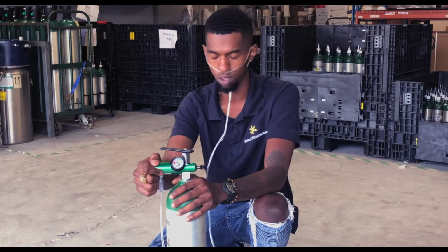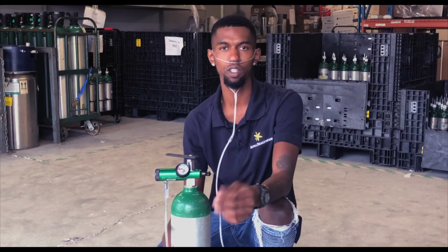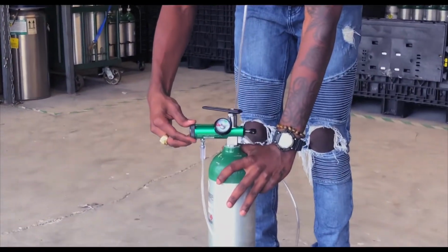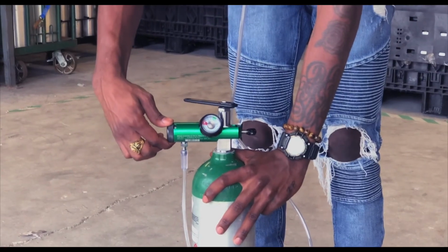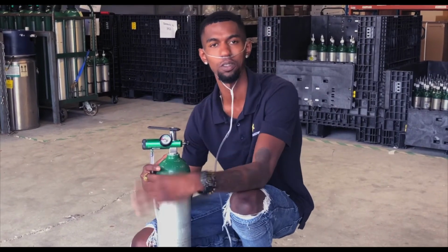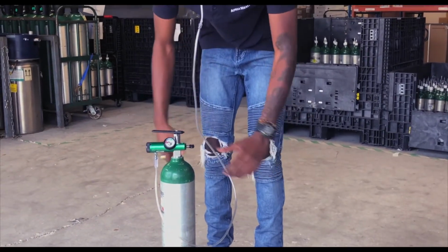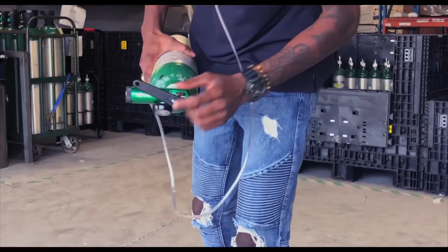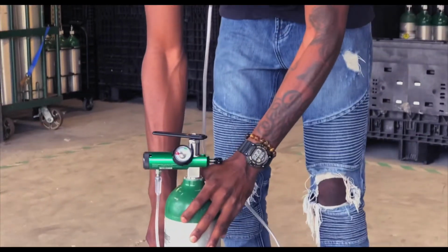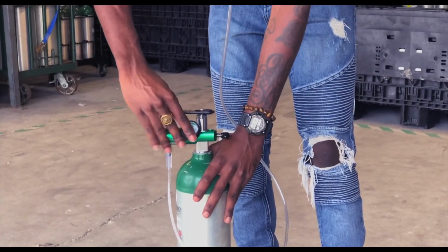So you want to find your liter flow. Hypothetically speaking, if I had just got out of the hospital, they gave me a liter flow of 3. What I'm going to do is go to my regulator, start at 0, and twist it until I see 3. Once I've found my liter flow, which like I said is 3, my hypothetical liter flow, I'm going to look at my key and say, okay, key, how do I get this oxygen out of this tank? Like I said before, on the tank there's an arrow indicating which way I should turn it so that I can get oxygen. So I'm going to turn my key counterclockwise and let's see if I get oxygen. Boom.